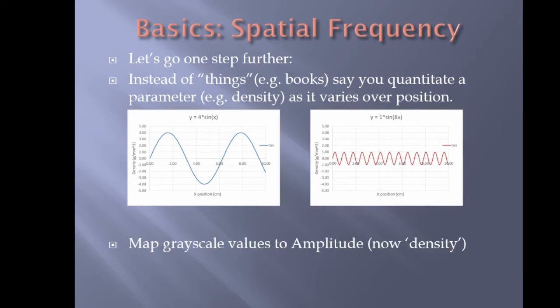And so here we see there's a variation in density where the density gets higher and higher over 2 centimeters and then lower. So over every couple centimeters, we have a large density fluctuation, or we have a small density fluctuation over a much smaller spatial scale, right?